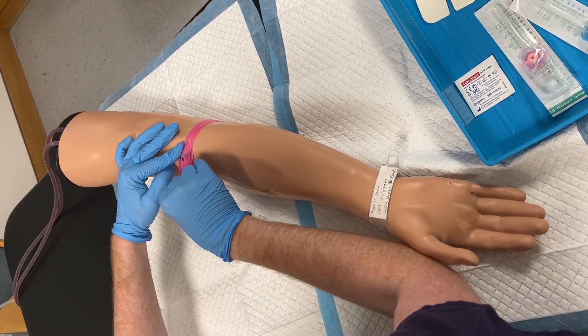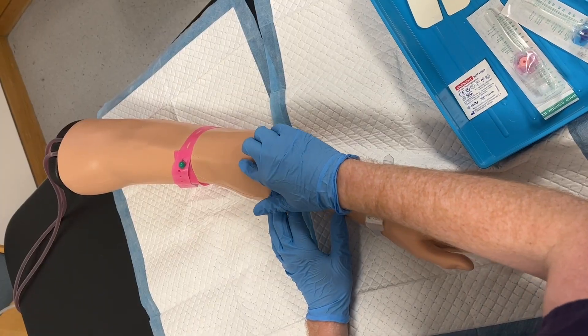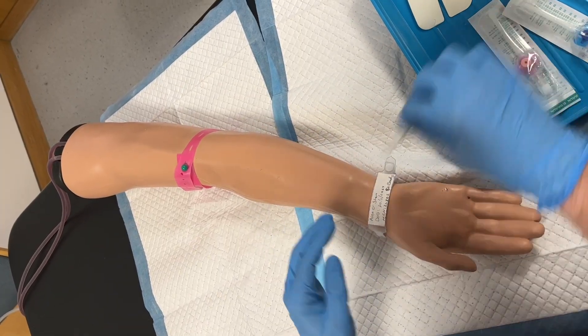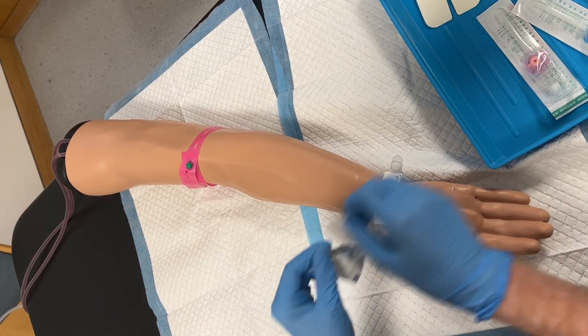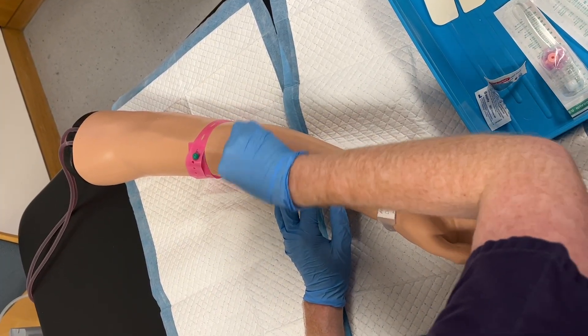Place both yourself and the patient in a comfortable position. Apply the tourniquet and then begin to palpate for a suitable vein. In most cases, a vein that is easily palpable is preferable to one that is only visualised but not palpable onto the skin.